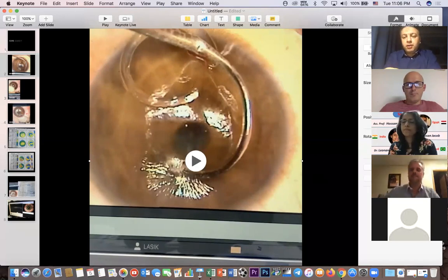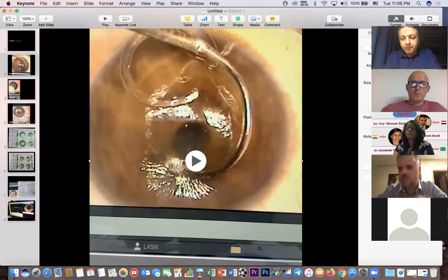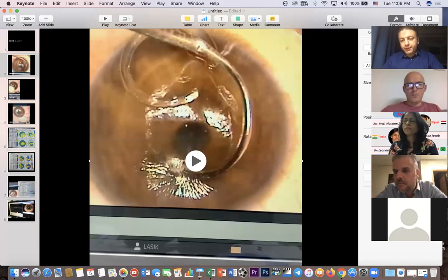Yeah. Okay. No, I have no problem with the rings after cross-linking with the femto laser. Okay, but you may find a difficulty in some primary, some virgin corneas. No, there's no difficulty. Okay, so what could be the cause of difficulty?